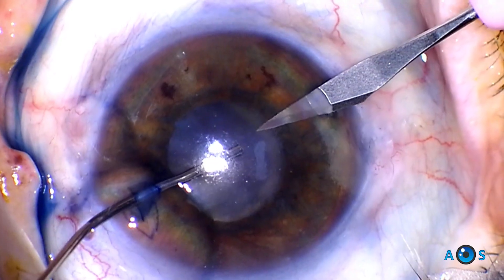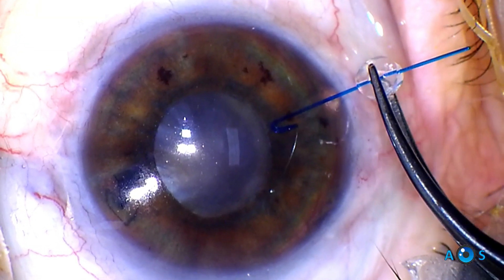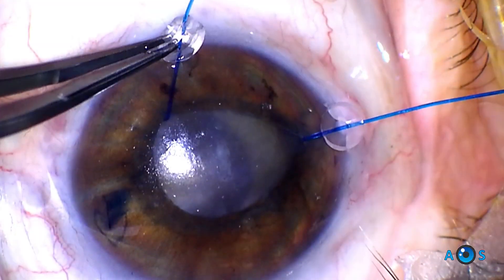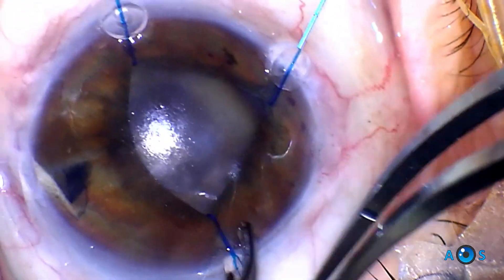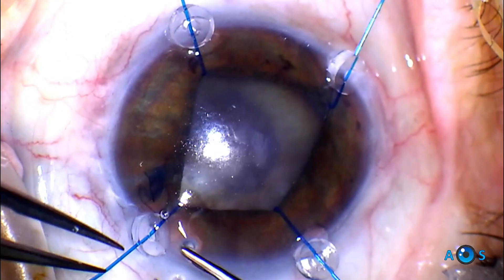The cataract surgeon begins as standard. Notice the poor pupillary dilation. Considering the dense nucleus and phacodonesis, iris hooks will be mandatory to expand the pupil. The 15-degree blade is used to create four corneal incisions, parallel to the iris plane – this will ensure optimal creation of a square-shaped pupillary opening.